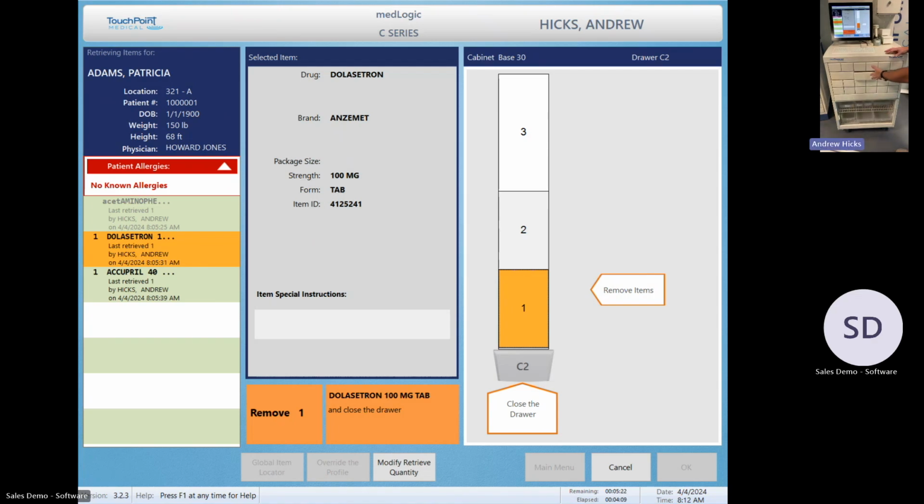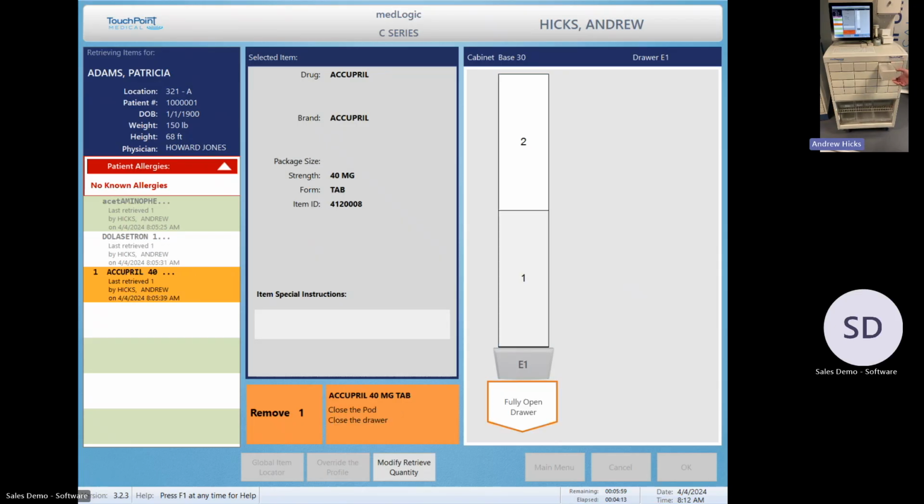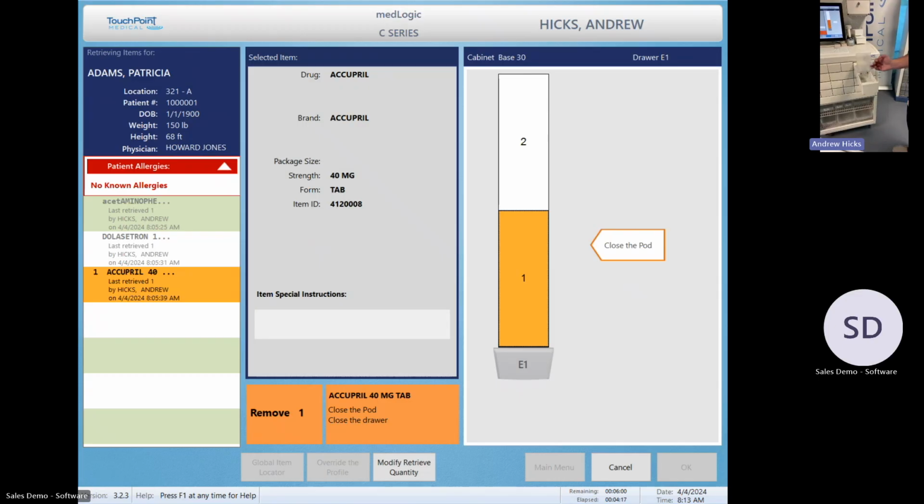You would pull that item out, close that, and then we'll show our last drawer. This last drawer happens to be what we call a lidded drawer. So this is for single item access. When that drawer comes fully open, that lid pops open, and you now only have access to that one item. This particular size is what we call a double lid. There are also single size lid and triple size lids. So this particular drawer has two double lids.